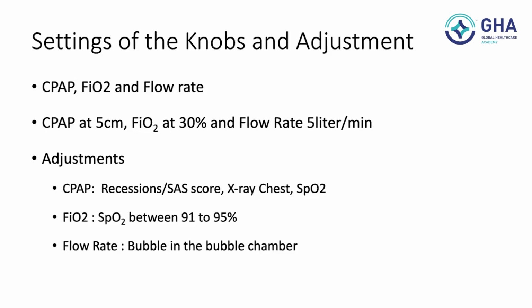What is INSURE and LISA? In the INSURE technique, while the CPAP is still there, we intubate the baby, put an ET tube and give surfactant. And after giving surfactant, you do a T-piece resuscitation while the CPAP is still there. Whereas in LISA, you put a small catheter into the airway and give surfactant, with no need for T-piece resuscitation, because we're using a very small catheter which doesn't occlude the airway.